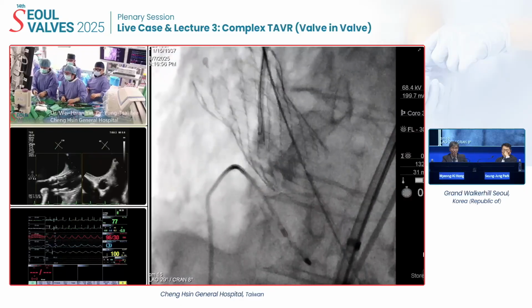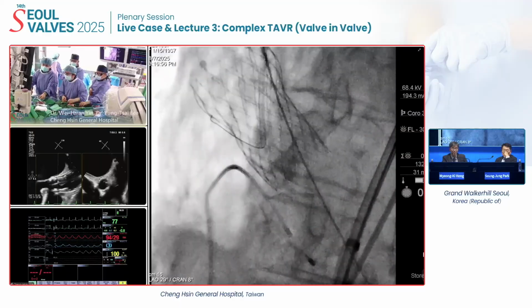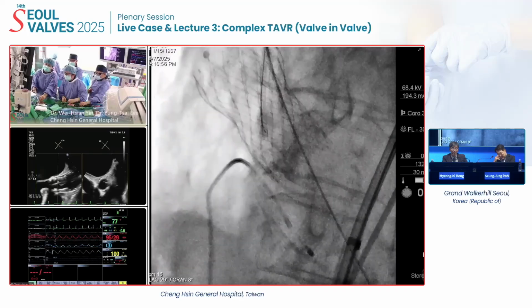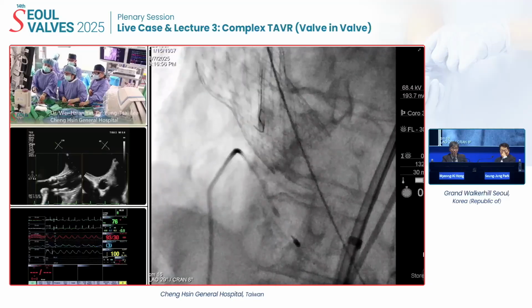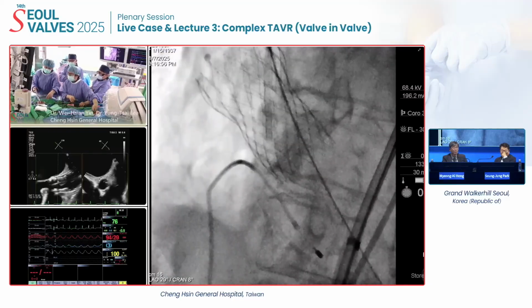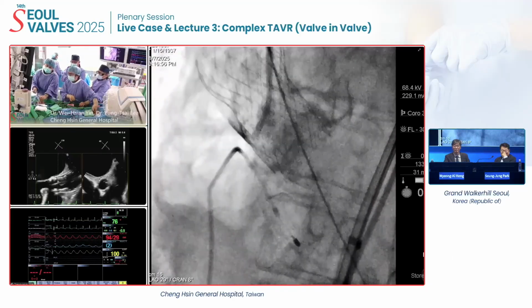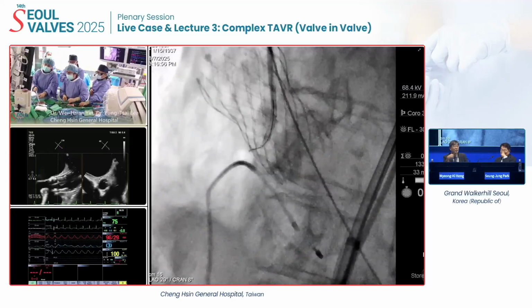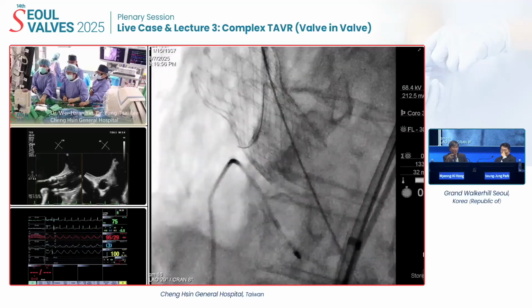We are now protecting the right coronary. The engagement is not so good because of the anomalous opening of the takeoff of the right coronary. So we use a fishing technique. Use Sion blue wire. On the screen, the operator is changing. Yung-Tsai is at the back.